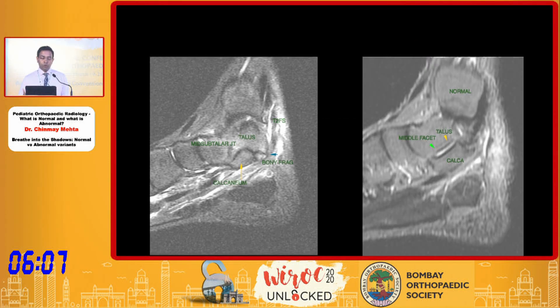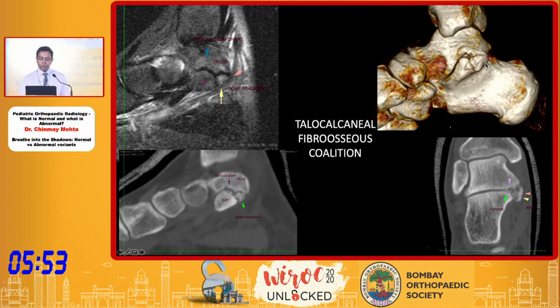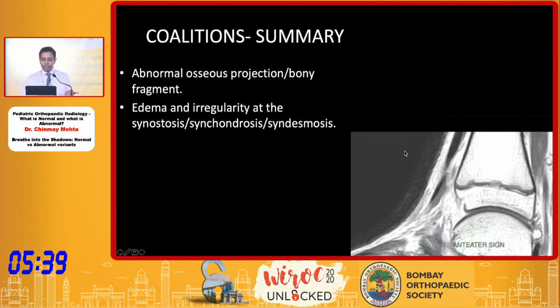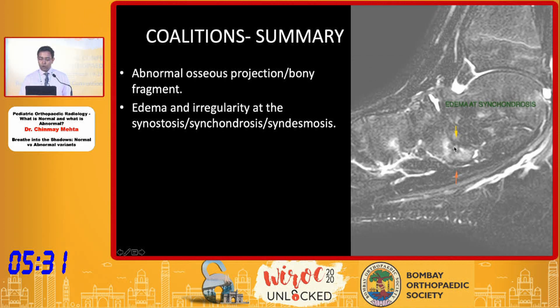This is a typical case of talocalcaneal fibro-osseous coalition. On the normal fat-suppressed sequence there is no edema at the middle subtalar joint, whereas in our case there is edema. On CT sections we see the extra osseous part — part of the coalition is fibrous and part is osseous. To summarize coalitions: any abnormal osseous projection or bony fragment as seen in the anteater sign — that's the calcaneonavicular coalition — and edema at the synchondrosis, synostosis, or syndesmosis would point towards a coalition.